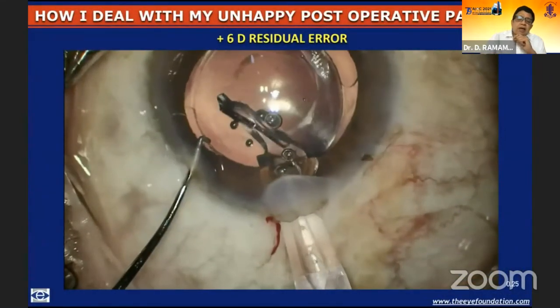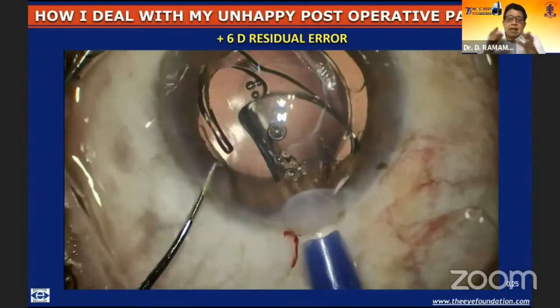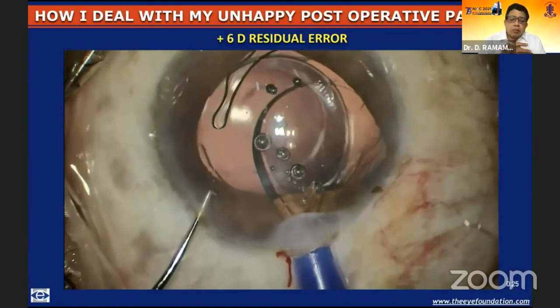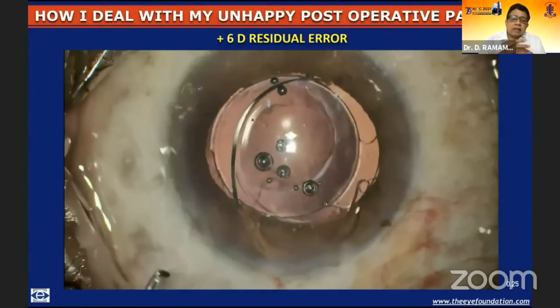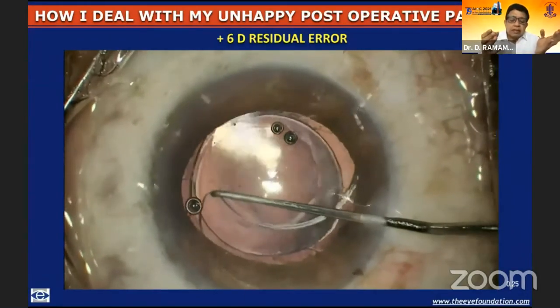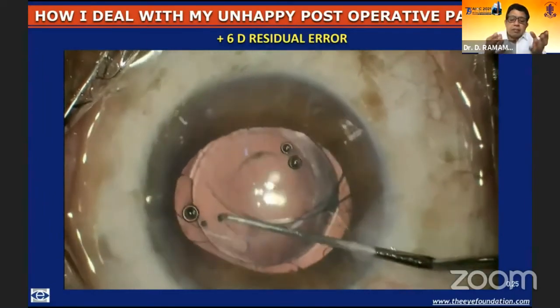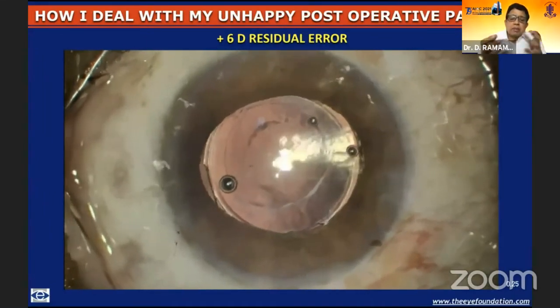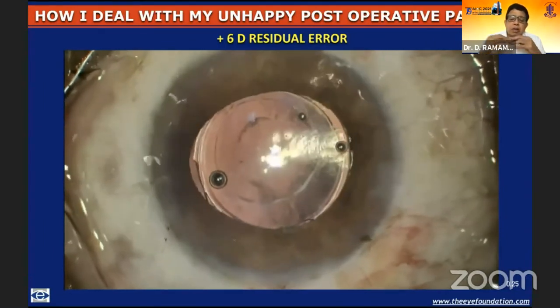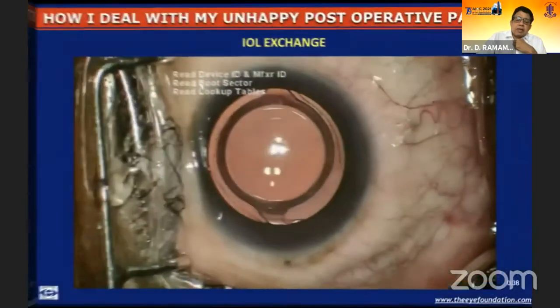Just in case the refractive error is quite high, as in this case, which came to me operated elsewhere almost 3 years back. It was a post-refractive surgery scenario, and the error was to the extent of about +6 diopters. So obviously, explantation of the lens is out of the question because I might disrupt the capsular bag. Already a YAG capsulotomy has been done. So the simple process of putting in a piggyback lens, where the formula is that for each diopter of hyperopia you require 1.5 diopters, is a good way to go. And this gives you excellent results.